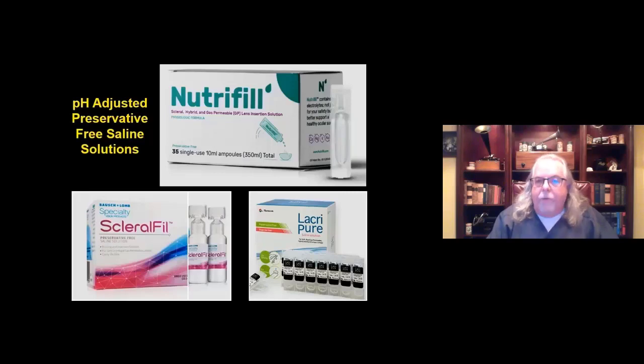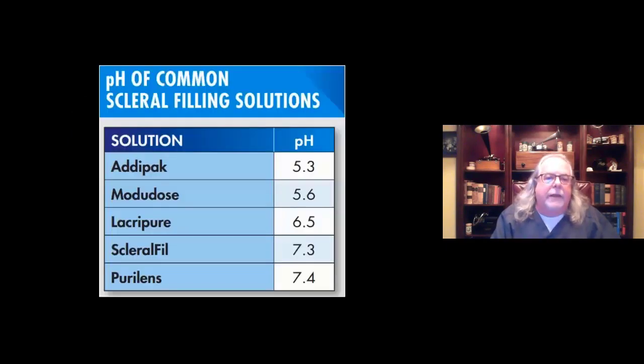But now we have some additional saline solutions. It's important that we understand why these other salines appeared in the marketplace. And really, it has to do with this little feature, and that is the pH of the preservative-free saline solution.